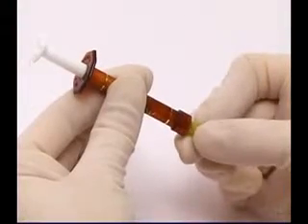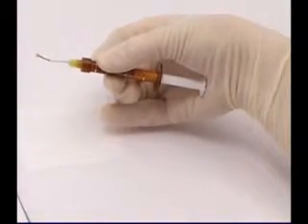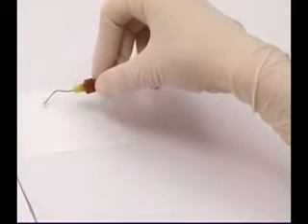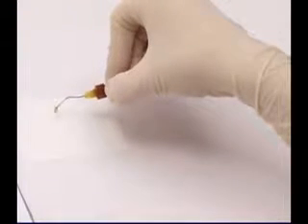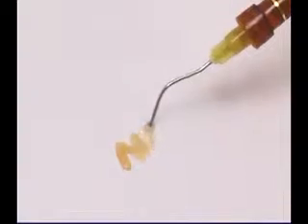A Dento Infuser tip is now attached to the syringe. To ensure a smooth and consistent delivery of Viscostat, the syringe should be held as shown here, using the palm of the hand rather than the thumb to depress the plunger. Check for evenness of flow before dispensing intraorally.